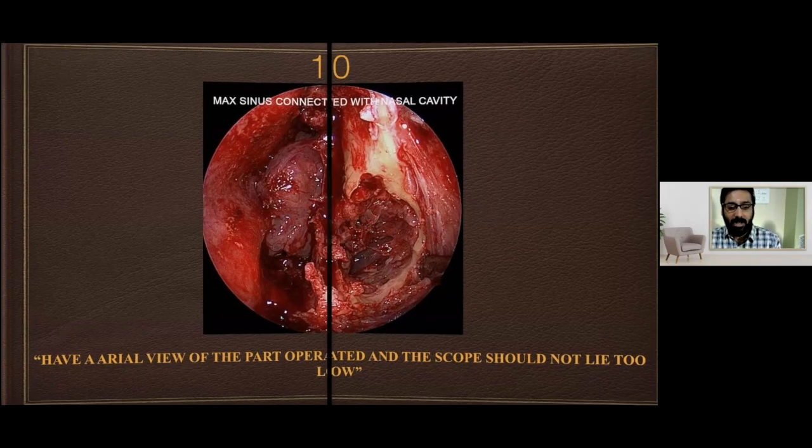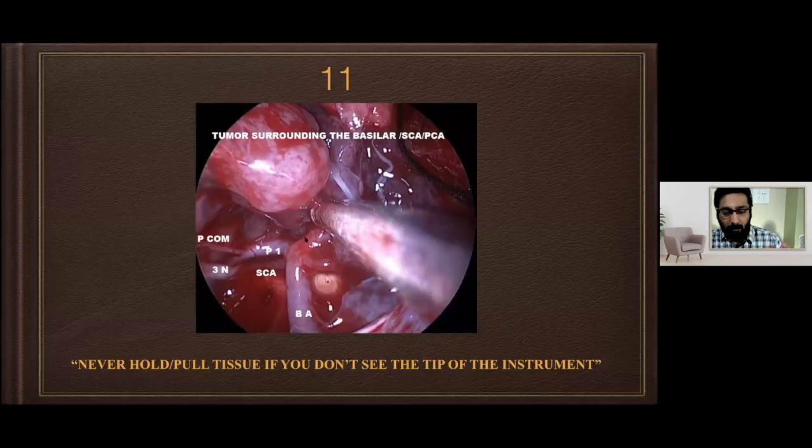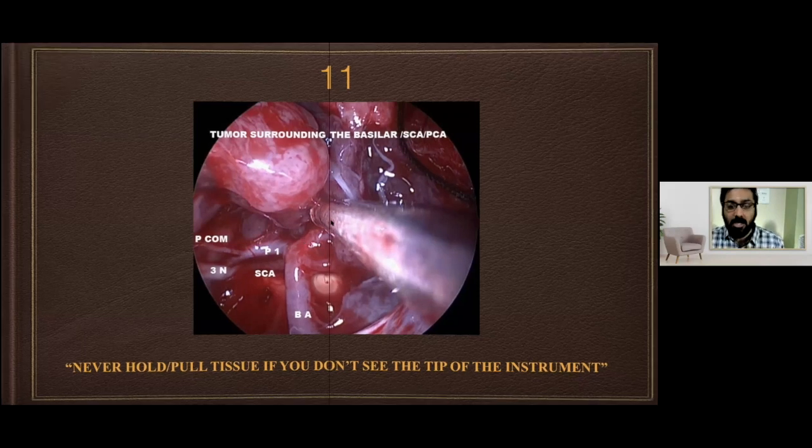And when you're operating near the perforators, this is very important. I've seen many people pulling at a craniopharyngioma. This is actually dangerous. Skull-base surgery is all about microdissection. Whatever you do from outside, it's exactly the same. So don't ever try to pull any structure inside. For example, a tumor like a pituitary. I never use curettes. Curettes to me are not great instruments to do pituitary surgery, even if you do an extracapsular dissection. So here we are.